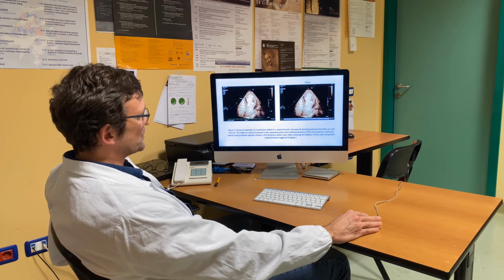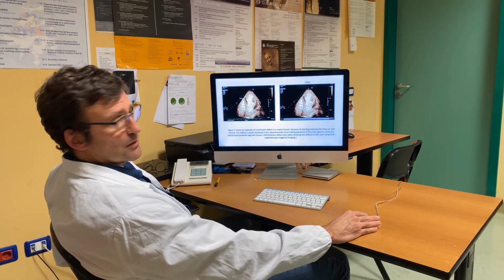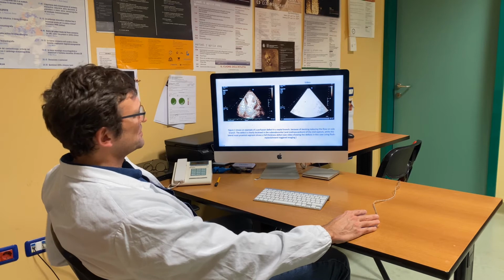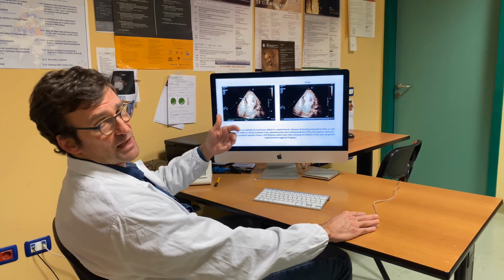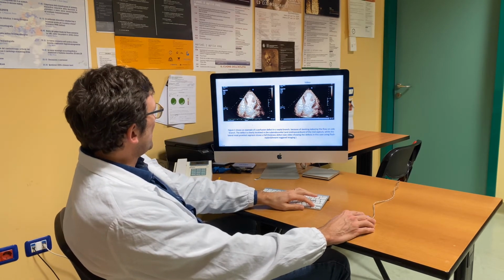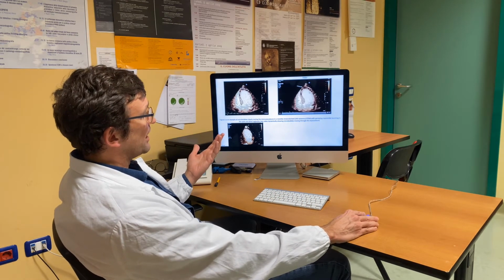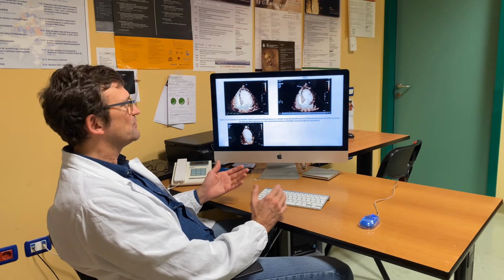So this was a stented LAD where the septal branch was occluded by the operator, and we could very easily spot it. This is triggered imaging, so you use just a few images typically at end systole, but you can use real time, as we have shown in the prior images like this one, where you can assess at the same time wall motion and perfusion, and just few methods would give you this capability in real time.